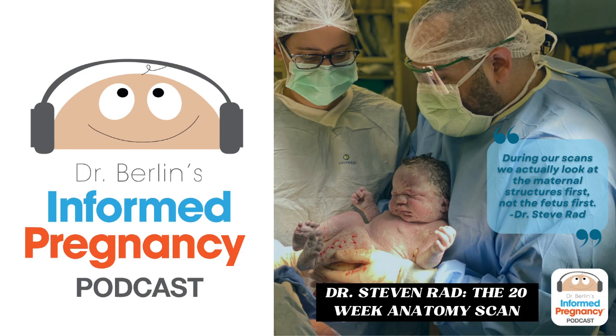So we look at the thigh bones and measure those. We look at the leg bones and can measure those. And we look at the feet and toes. And then lastly is the spine. You want to look at the spine appearance, shape, my favorite part, and position.